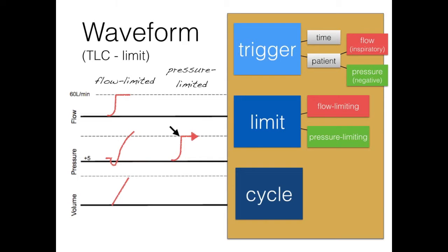You will notice on the pressure-limited flow waveform, the flow shoots up and then starts to drop in a ramp-like decelerating fashion. This guarantees that unsafe levels of airway pressures never occur, and that the delivered gas spreads slowly, especially in heterogeneously injured lungs. Choosing pressure-limited ventilation thus prioritizes safety over efficacy. In comparison, volume-limited ventilation will guarantee a certain tidal volume at the expense of high pressure levels, whereas with pressure-limited ventilation, although the tidal volume is not guaranteed, the airway pressures can be controlled.